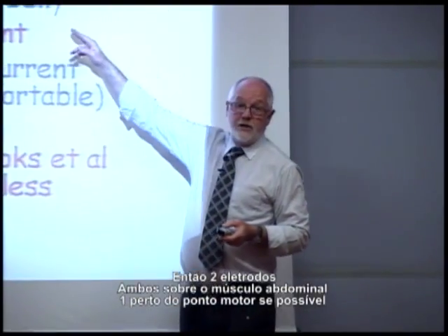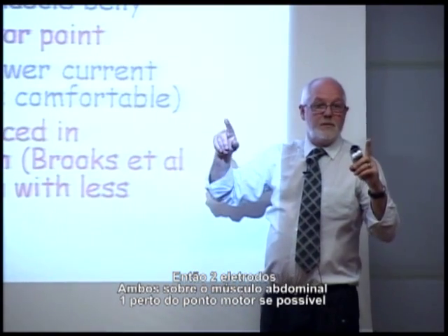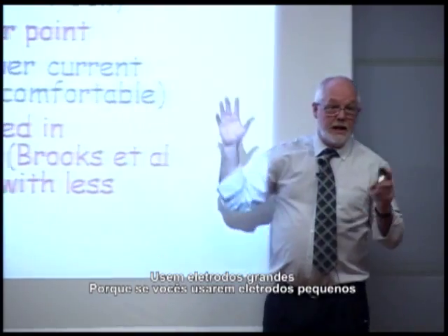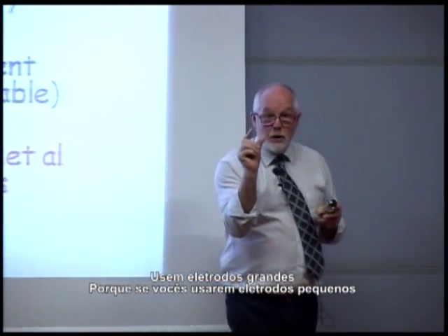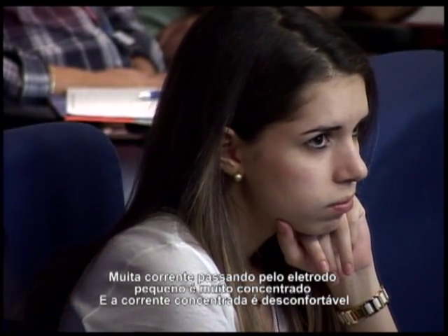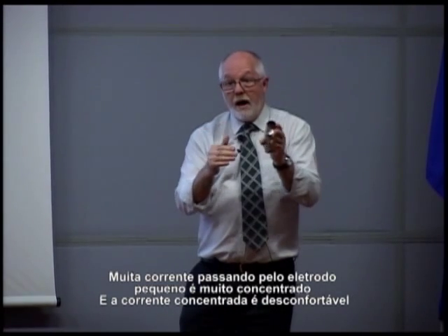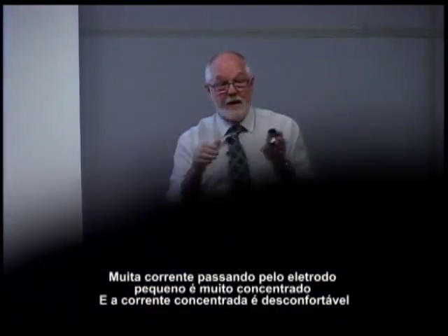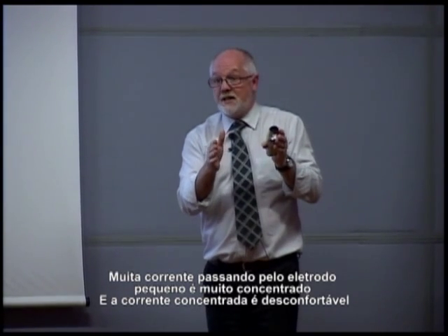So two electrodes, either end of the muscle belly, one near the motor point if you can. Use large electrodes, because if you use small electrodes, you've got a lot of current going through a small electrode. It's very concentrated, and concentrated current is unpleasant. It hurts.